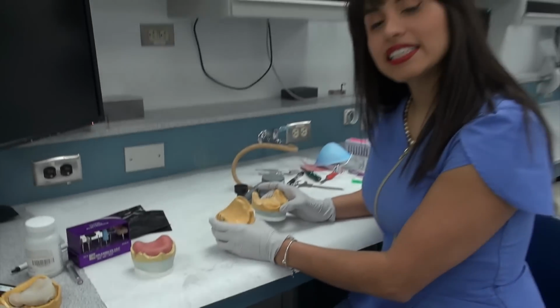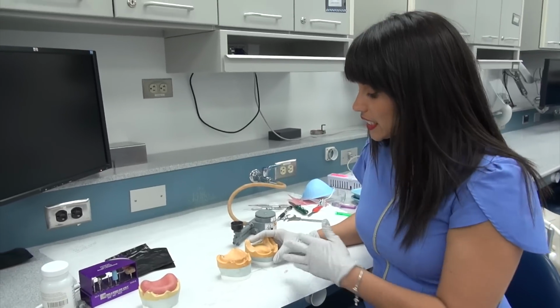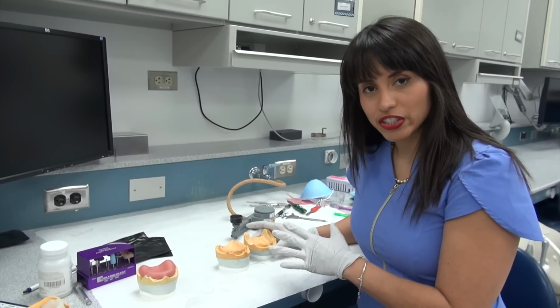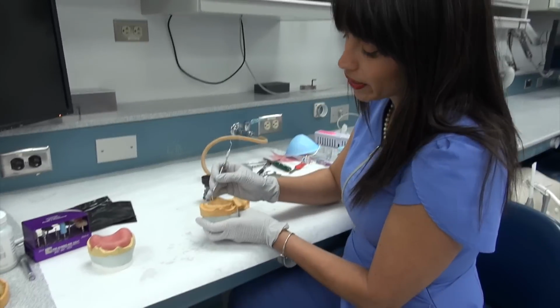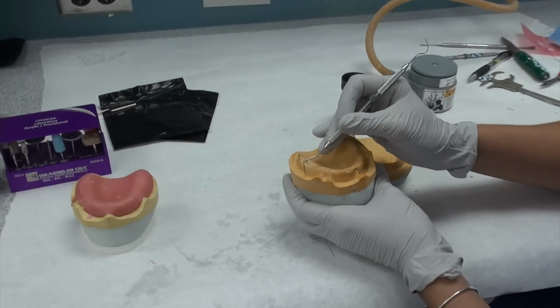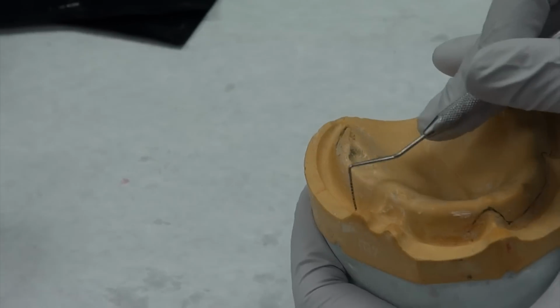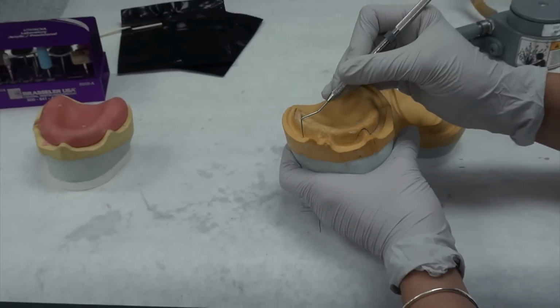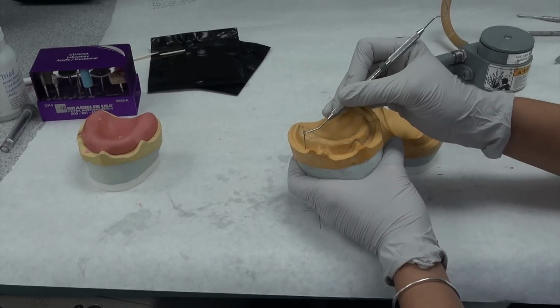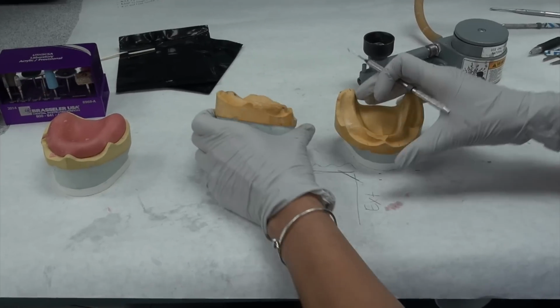Now, some key things to take note. If you saw the last video, we discussed many of the important land features. Now, the most important thing in today's video will be to make sure that you are 2 millimeters in depth from the land area of the vestibule. That's because anything over 2 millimeters will make it difficult for the triad to cure.